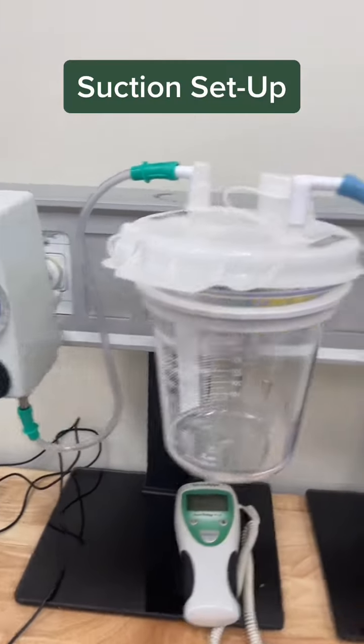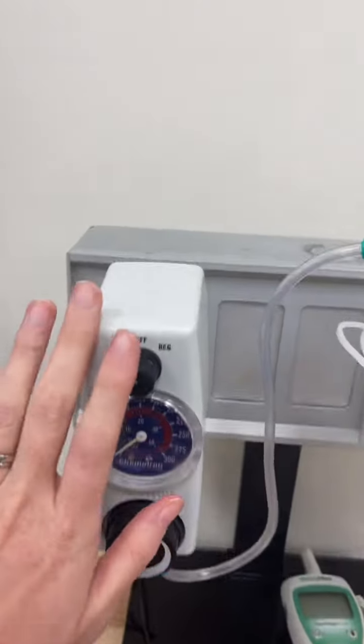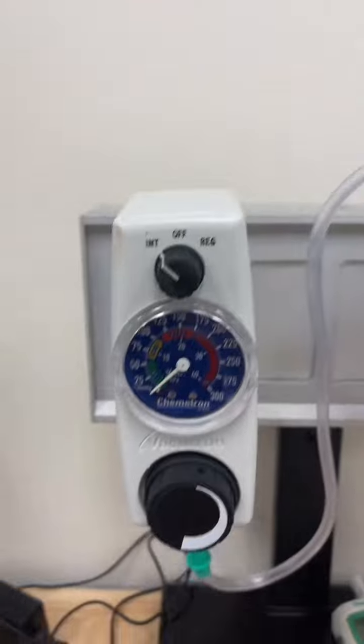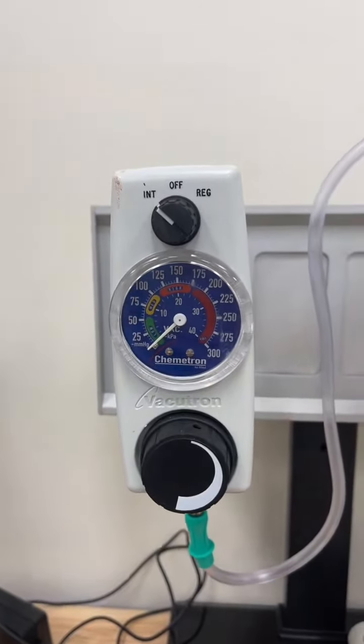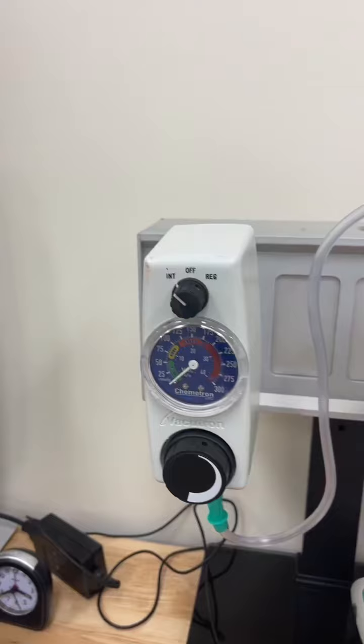So here's head of bed, okay? These are the typical things you'll run into. Okay, so first I want to talk about suction, okay? So the suction head can look like this. Or here's another example of how suction heads look.